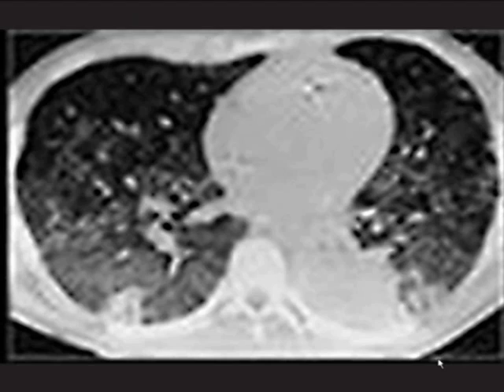the good alveoli are going to expand and explode, and the bad alveoli will never see any of that tidal volume. So essentially, even though they're fully functioning adults, or maybe not so fully functioning at this point in their injury course, they really have the lungs of babies. They have tiny little lung areas that actually are available for gas exchange. So you want to lower the amount of gas you're actually giving them. That's why you use low tidal volume.